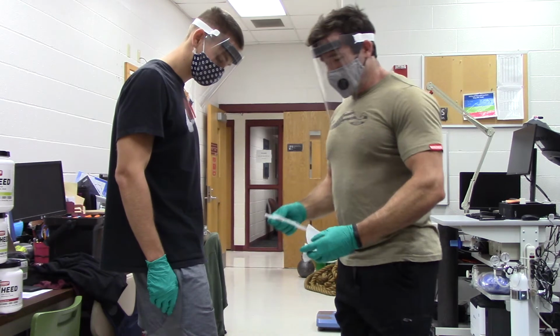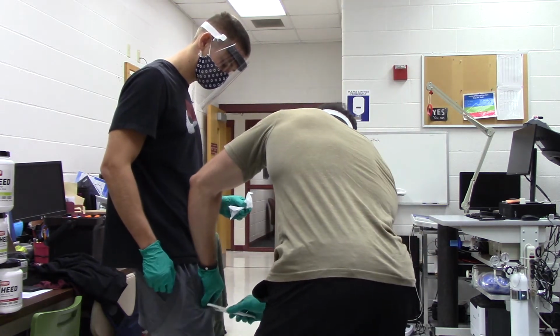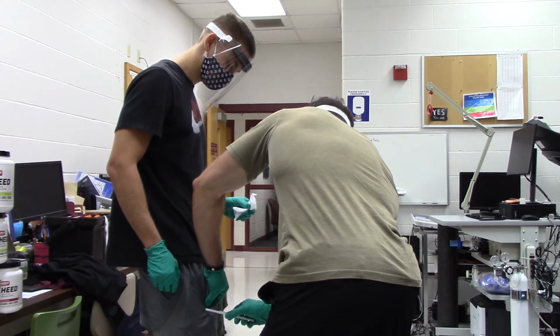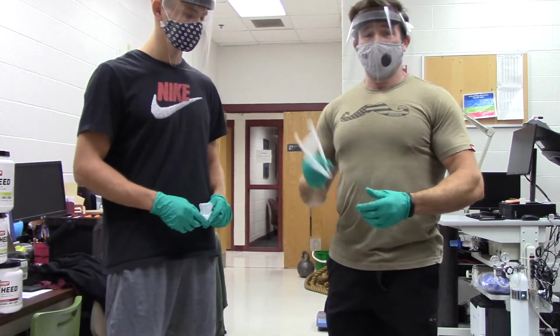So for Ihor, I'm going to have you take this. We're going to go ahead and grab the thigh. Yeah, he's a lean dude. Close it until we take the measurement. Open. You were really lean. Nice job, bud. And now we've got the thigh measurement.